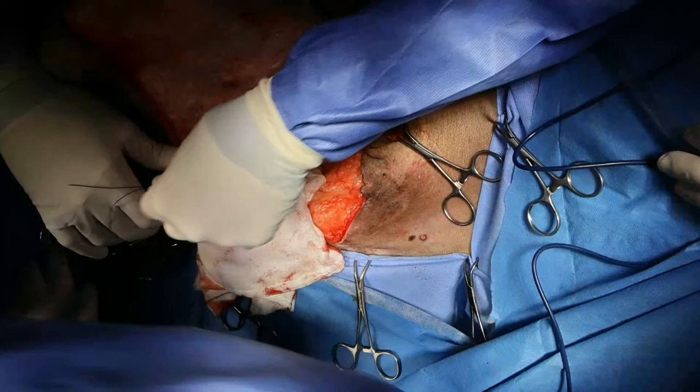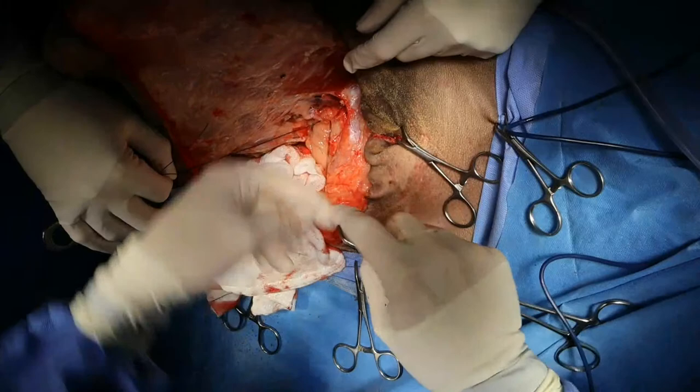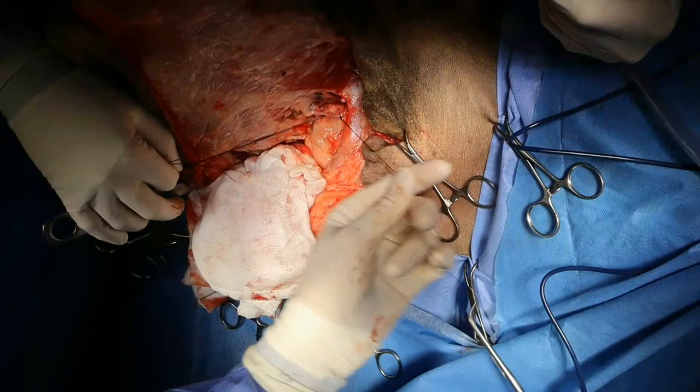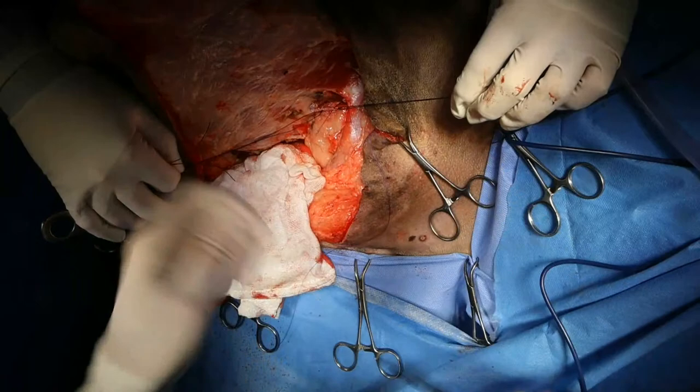So, Sean, do you know how many throws you need on silk to have a secure knot? 4 to 6. Interestingly, it's just 2. That's the only suture that is secure with 2 throws. I still do 5 or 6, mind you. Sleep better at night. So another transfixional. The purpose of the transfixional ligature is just to make sure that my primary ligature doesn't slip off.